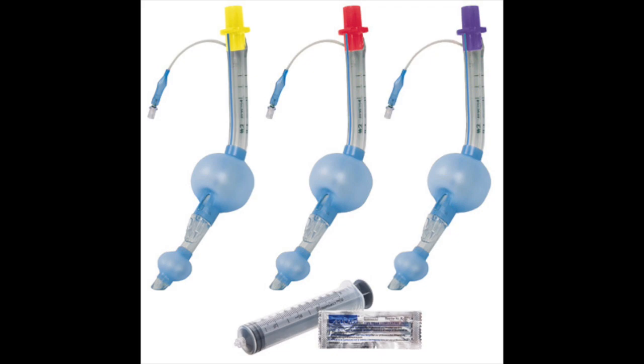King Airway is next generation CombiTube. CombiTube had two big bulbs that you had to blow up. It worked well, it was a nice device. But then the King came along, and the King just simplified it. There's still two bulbs that blow up, but only one tube to blow them up with, which is nice. Again, they come in different sizes. I'm not going to sit here and go through the ins and outs of the King. If you have the King in your organization, great. They work well. There's also the King LTSD that has a conduit for an NG tube or an OG tube or a gastric tube to be passed down through into the belly to decompress the belly, which is nice.